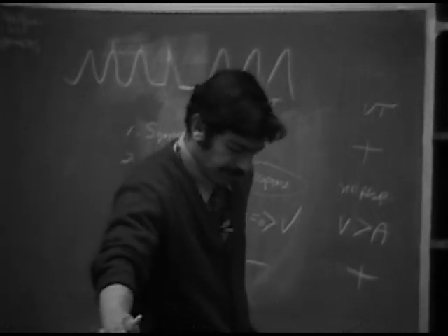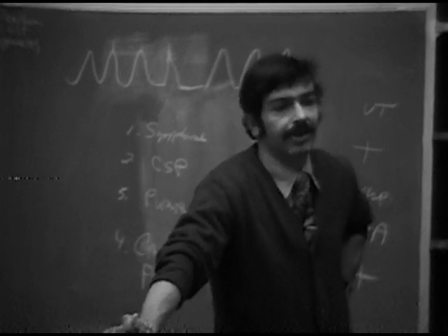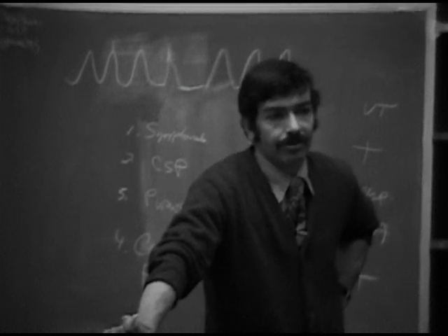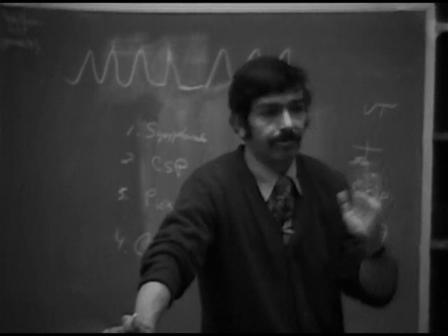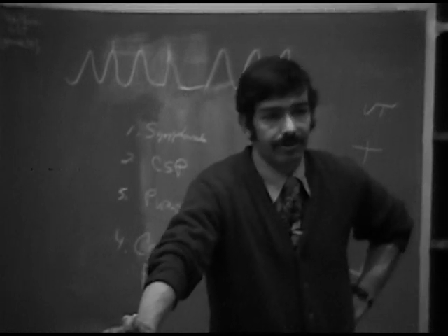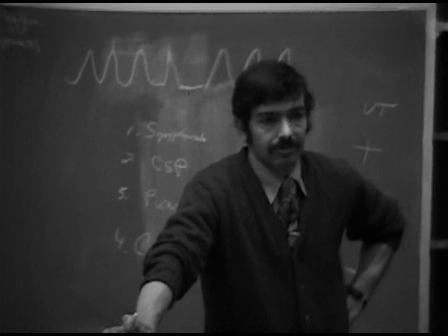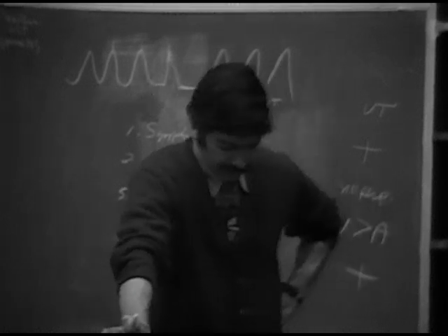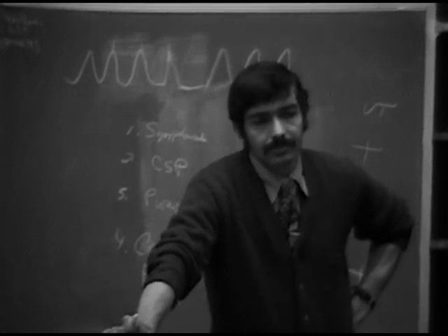If you had a long enough strip, would they occur in a regular pattern? Some patients with ventricular tachycardia may never have capture beats. And most of the ones that I have seen are really just random things. They just come in. Occasionally you'll see a patient with a fairly regular intermittent capture. I think that it varies. The thought is, if you have a regular atrial rate and a regular ventricular rate, which are different, mathematically you should expect an atrial beat to come down after the refractory period to the ventricles on a regular basis, assuming conduction is normal.